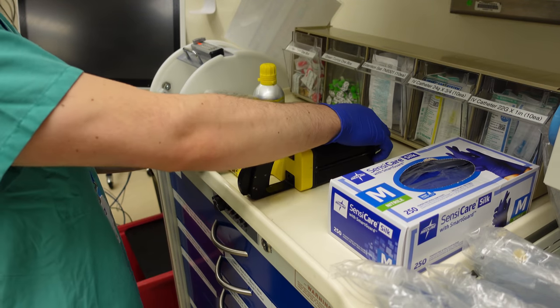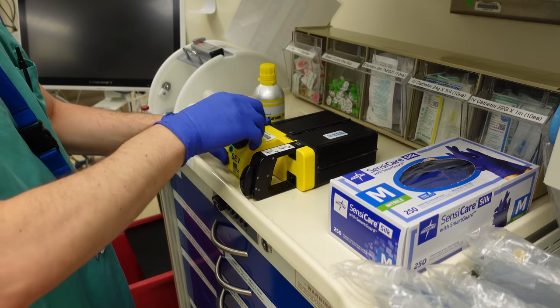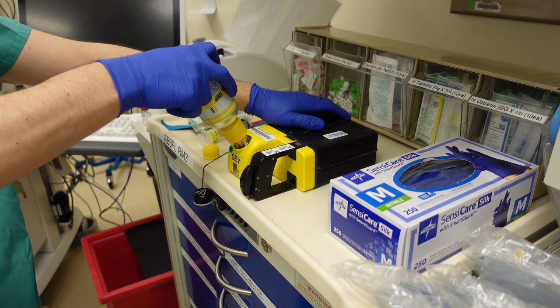The last part of my drug setup is topping off my volatile gas cartridge. Pediatric patients can go through a lot of volatile gas, so it's important to make sure this is ready to go.